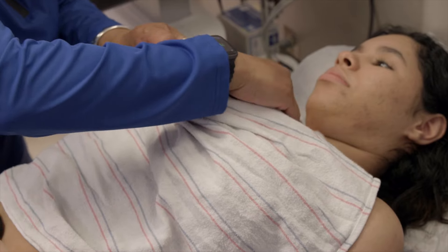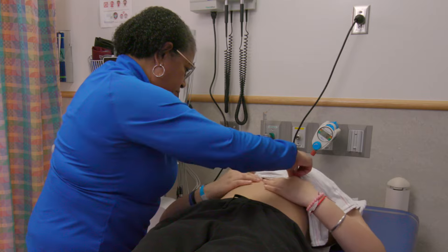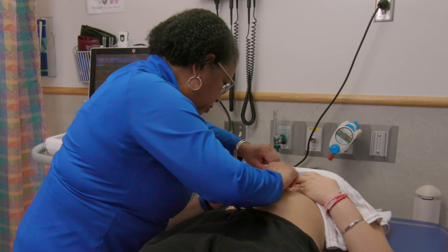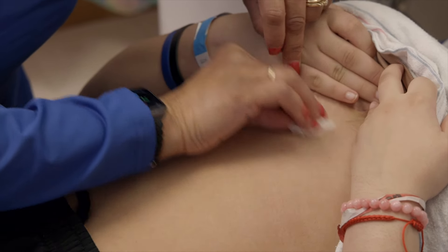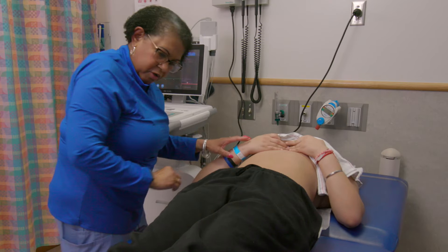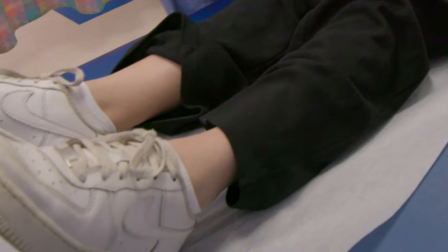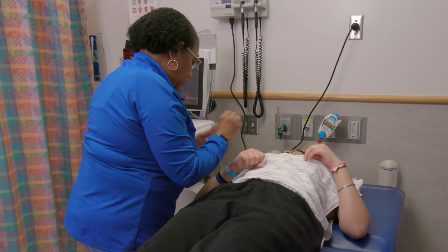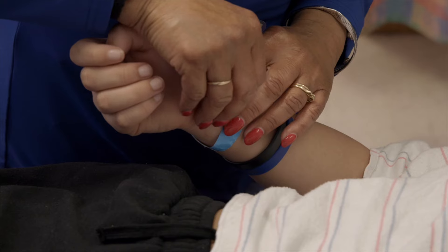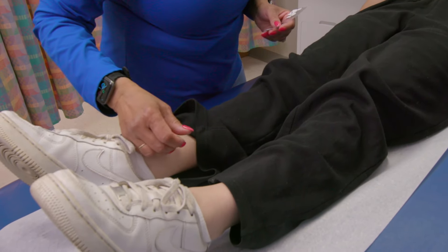Okay. I'm just going to ask you to — there we go. Just a little bit more. Awesome. I'm going to go down here to your ankles — same thing. Let's grab stickers on them. One on each leg, okay?